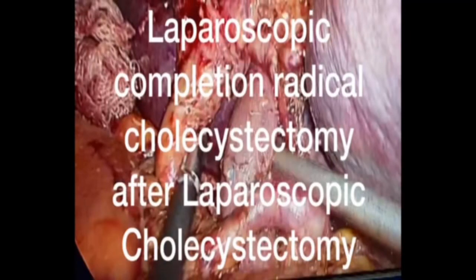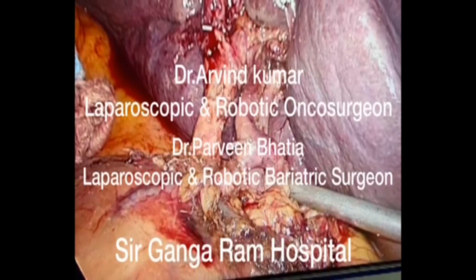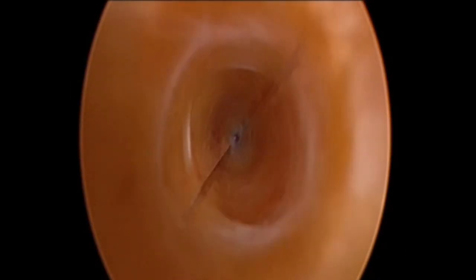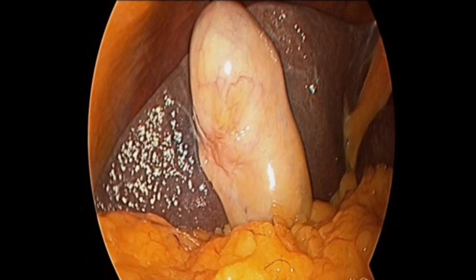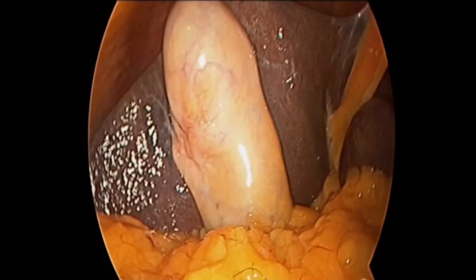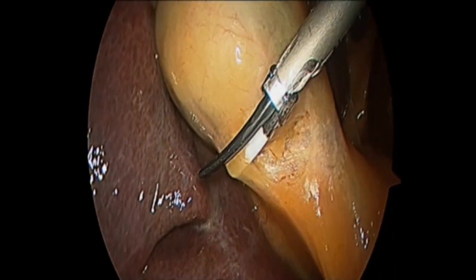Laparoscopic Completion Radical Cholecystectomy After Laparoscopic Cholecystectomy. We present a step-by-step approach of a 67-year-old male who had presented with cholelithiasis. Laparoscopic cholecystectomy was done, and the importance of critical view of safety is always emphasized.